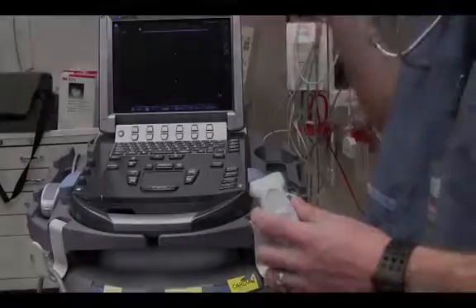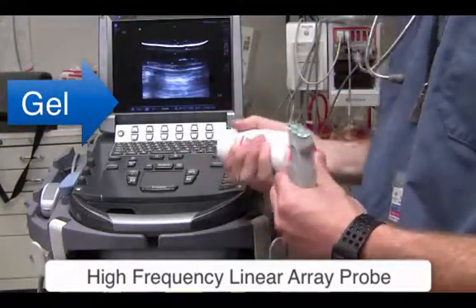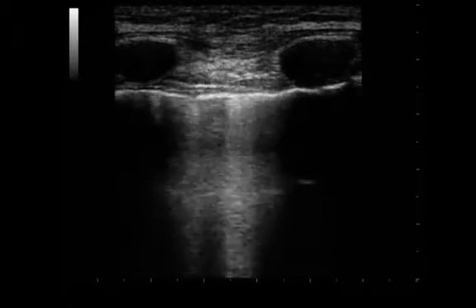We'll start with our high-frequency linear array probe. Put some gel on the probe and place it on the anterior chest wall. When you do, we should see something that looks like this. Now, don't worry, I've drawn a schematic.